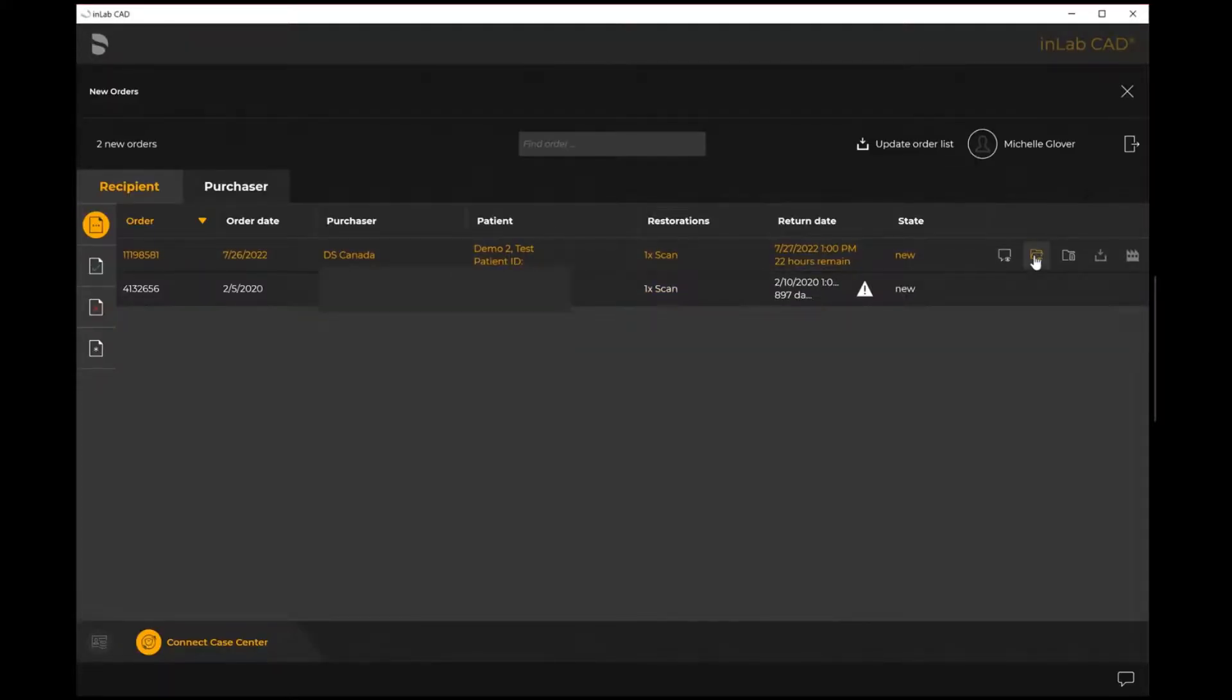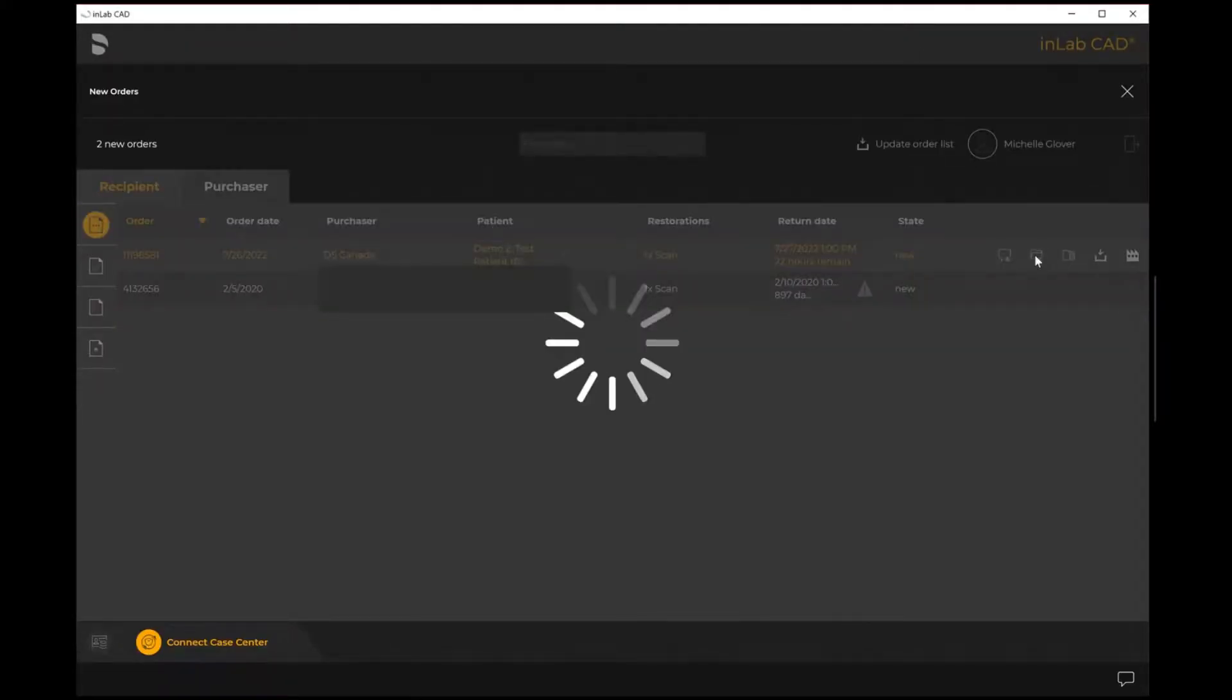The other option here for check order is I can select this option here to be able to identify if I'm going to accept or decline the case.